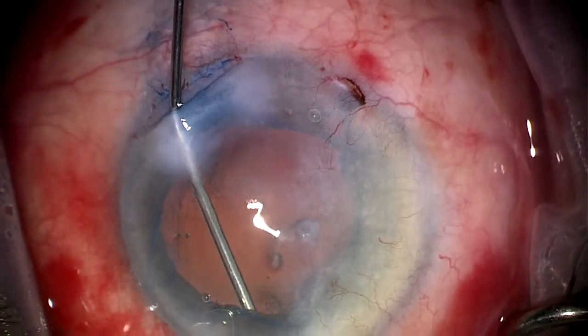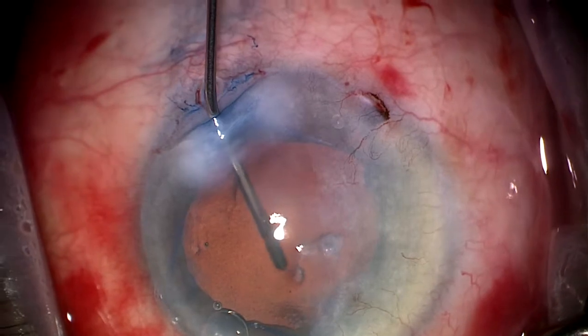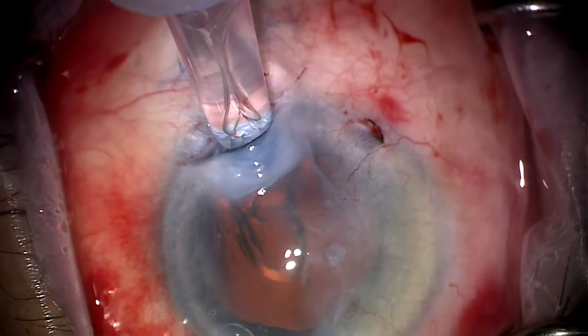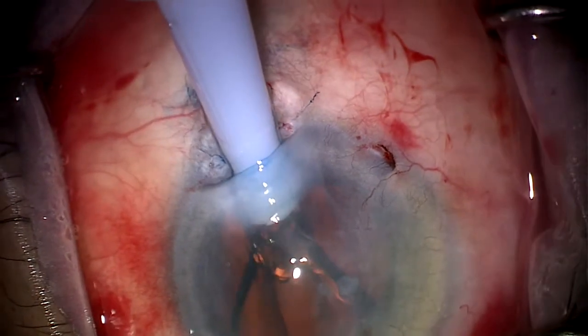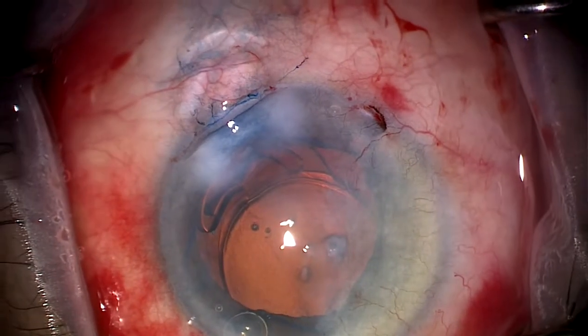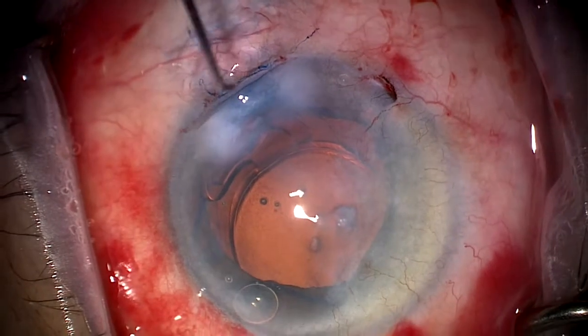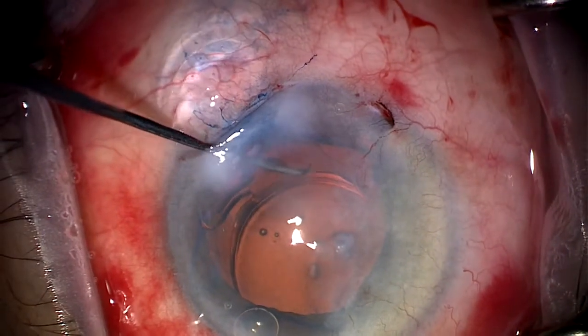We then inflate the capsular bag with ProVisc in preparation for implanting a one-piece Rayner aspheric lens, which is being injected here. Once we have injected the lens in, we use a standard dialing instrumentation to dial the lens into position.